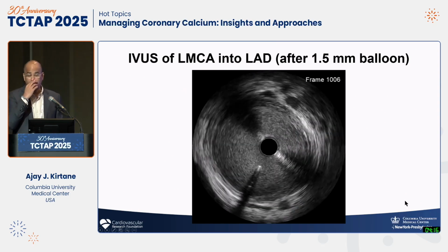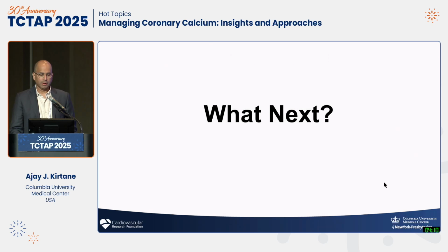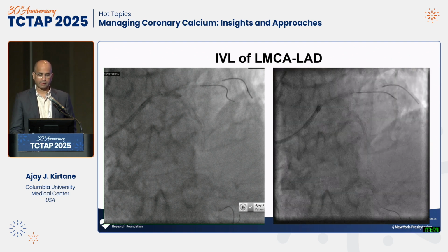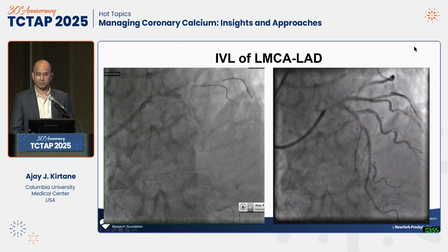So actually, I said, well, maybe instead of having to then atherectomize into the circumflex, what if I just modify this plaque in the LAD? And so basically, in this case, I did lithotripsy. So I took an IVL balloon from the left main into the LAD. I used the fact that that wire was next to the nodule. And after doing that, this is what the picture looks like. And you can appreciate all that haziness that was there at the ostia and the circ is better.